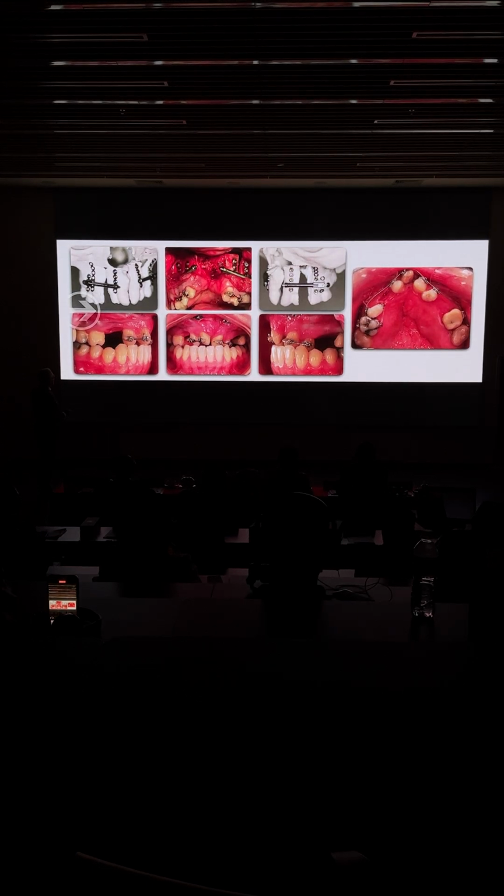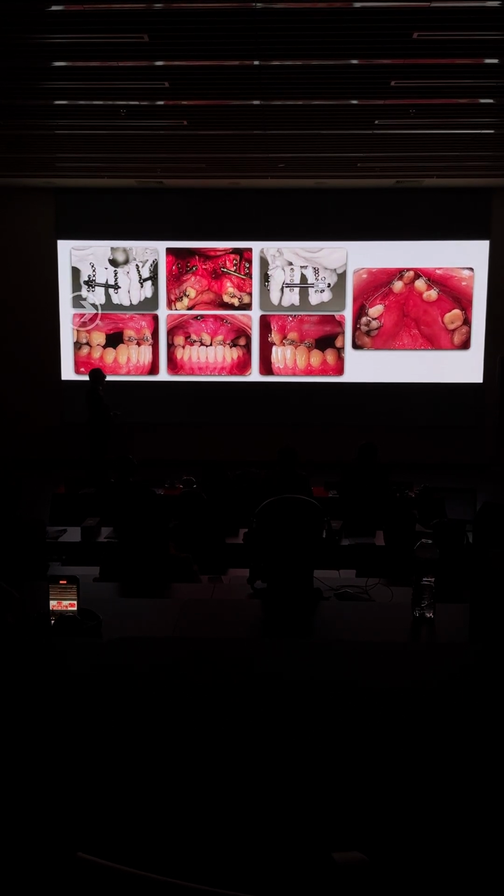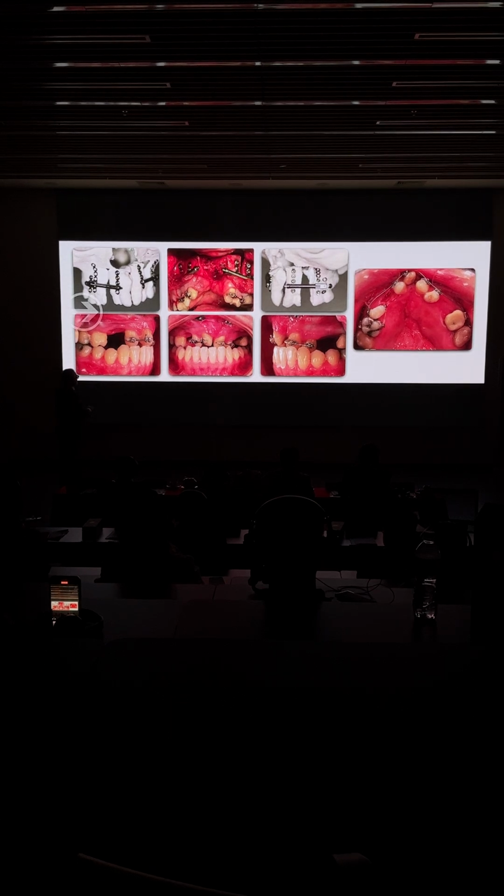And you can see the patient is moving 1 millimeter a day. They move all the pieces to the front, and of course she has a huge class 3. So we have to open and overcome this problem.